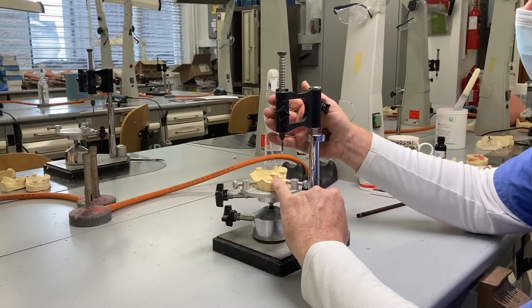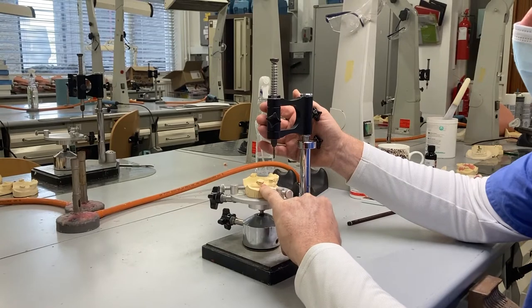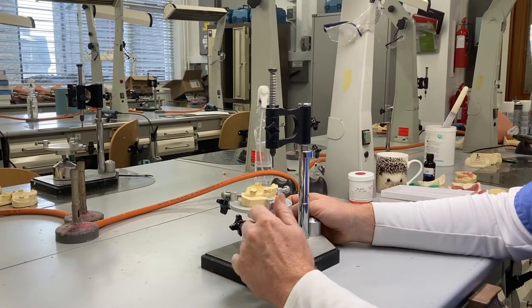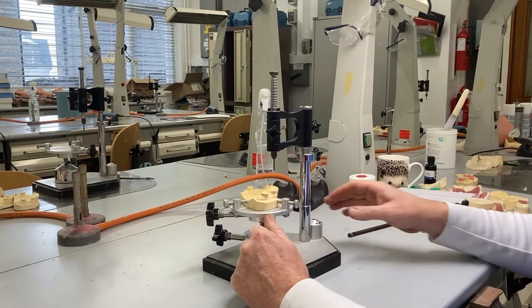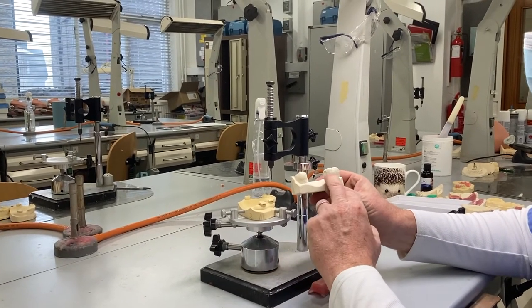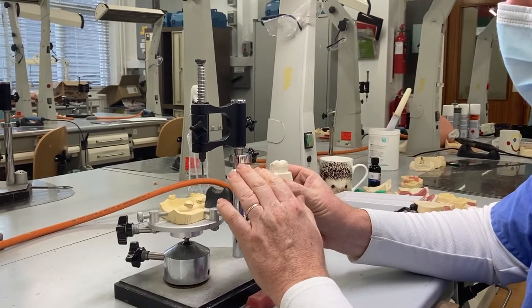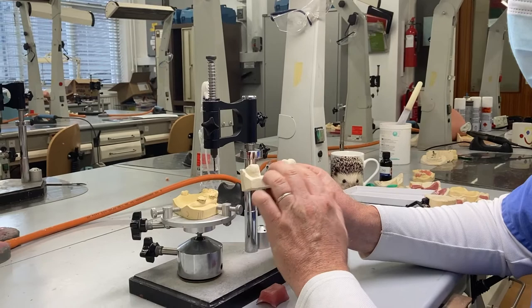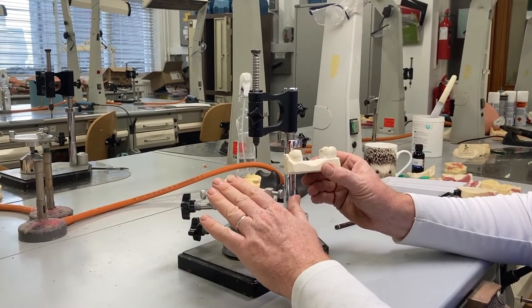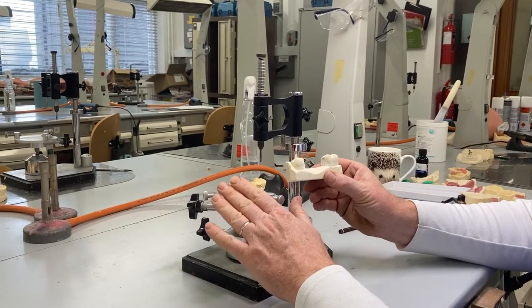So that's how we find the path of displacement. Now we can look at the undercut relative to this path of displacement and decide where we're going to position clasp tips and whether we're going to create a path of insertion. Most dentures are made with the undercuts blocked out relative to the path of displacement, which makes the whole process simple. The surveying is pretty much finished at this stage if we're just going to have a path of insertion that matches the path of displacement.